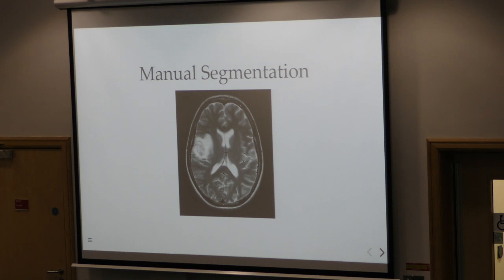But just showing, originally the most straightforward way you think to approach this is if you actually had a professional like a radiologist come in to manually define the boundaries of a given shape. So in this case, if I were trying to highlight a section here, I'd go in and manually draw out a pixel mask. In this case, it'll just be a segmentation of the ventricle in the brain.